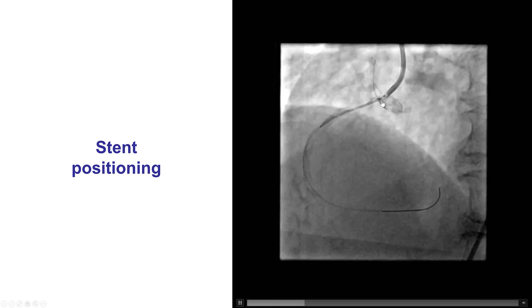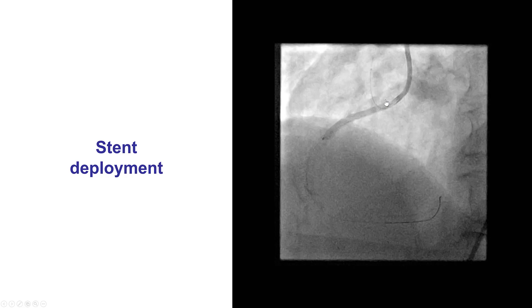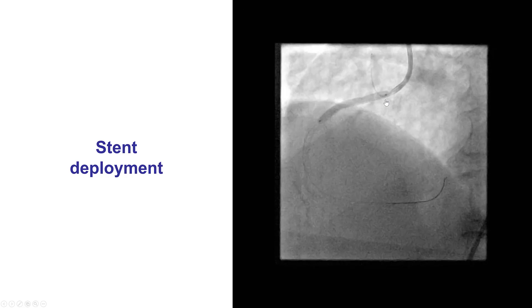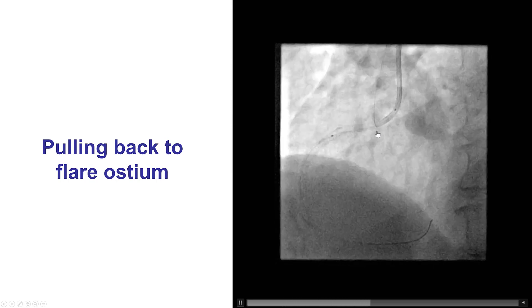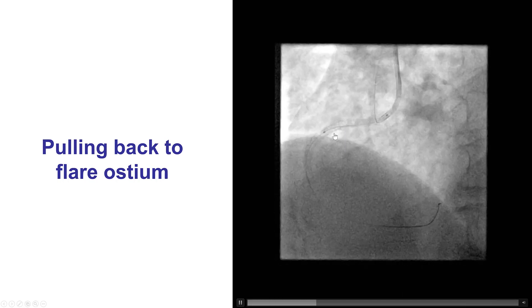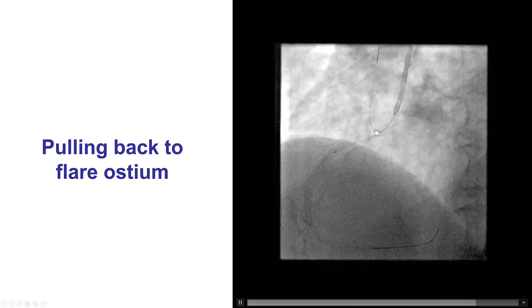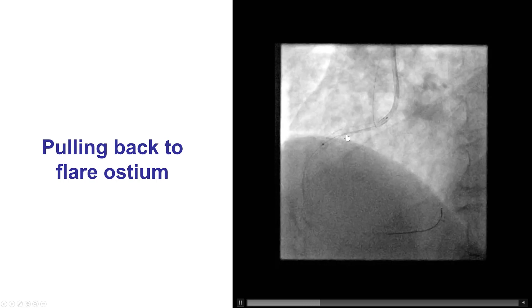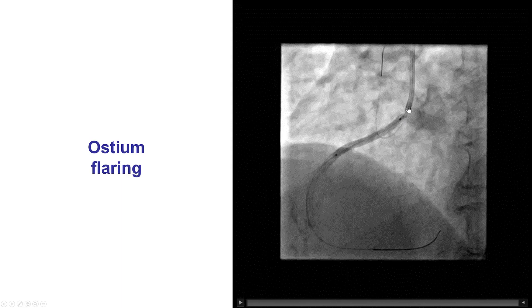Using the independent hand technique, we can move the stent back and forth and ensure that the stent is just outside the ostium of the vessel, demarcated by the wire. We can see here that the stent is barely out one millimeter, which is the ideal length. After confirming positioning, the stent is deployed. A critical step afterwards is to maintain wire position and use the independent hand technique to pull the guide back with the left hand, while simultaneously drawing back the stent balloon with the right hand, and then inflating to further flare up the ostium at even higher pressure than the original deployment pressure.